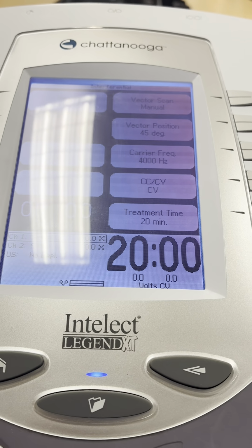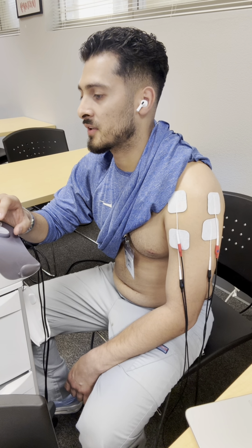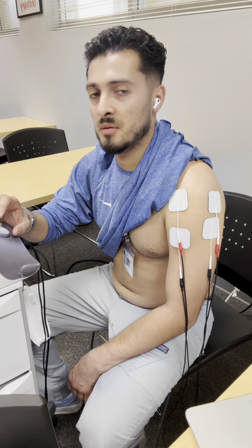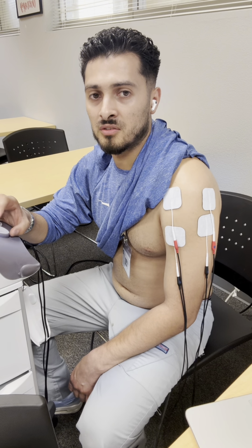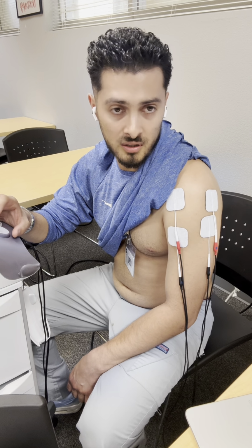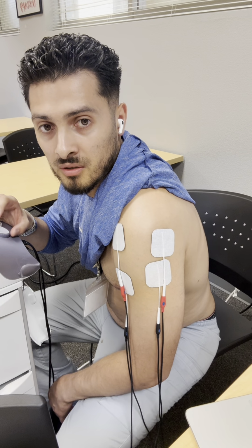Since I do have the beats at a higher hertz frequency, it's going to be that buzzing, tingling sensation. If you start going high enough, you'll start to get a contraction going on there.